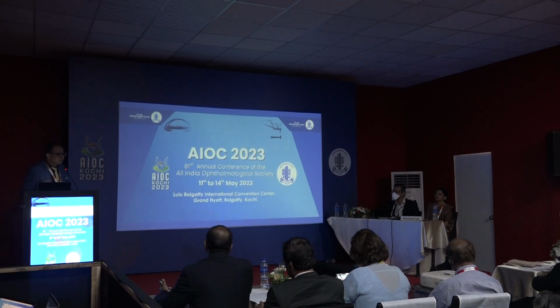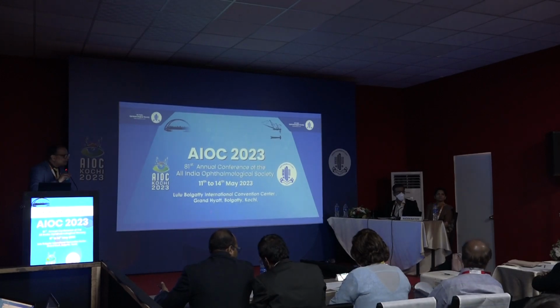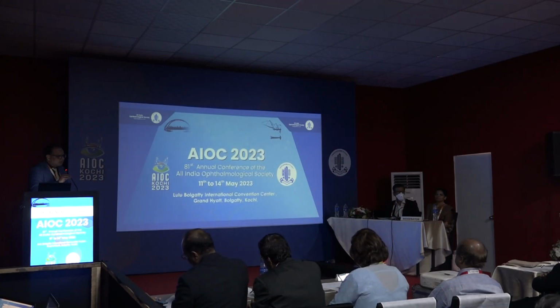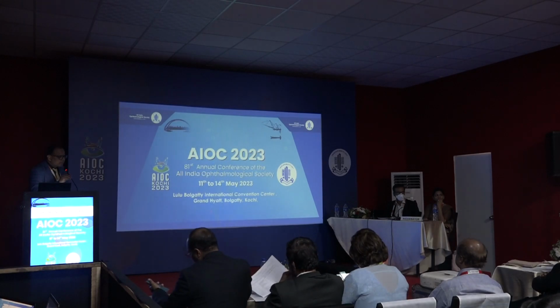Okay. So the two things which really work are to make a small capsulorhexis initially and extend it, or to do some form of a spiral rhexis. These are the two standard types of rhexises. If your needle puncture is releasing the pressure sufficiently, we should be able to make a normal primary capsulorhexis. So can you do that after you make these punctures? Can you make a normal 5 to 5.5 millimeter rhexis? Yeah, that is achievable almost every time.